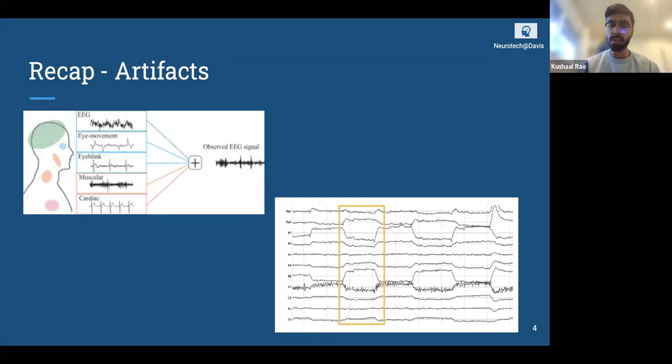But your body in general is also an electrochemical system. Your muscles, when you move, have electrical signals and electrical components to them. Your cardiac muscles, for example, your heart rate, is also electrically driven, with an electrochemical basis. So your entire body is an electrochemical system, not just your brain. And so any other signals that are being elicited from different parts of your body can also be picked up by the EEG data collection system.